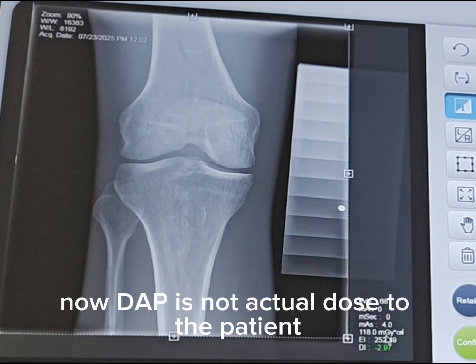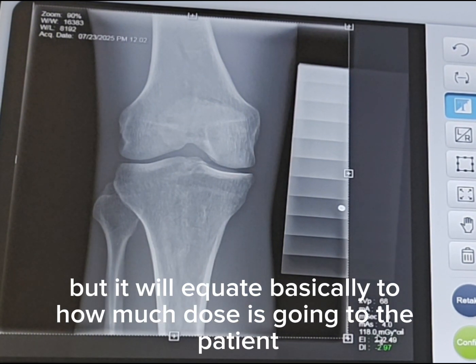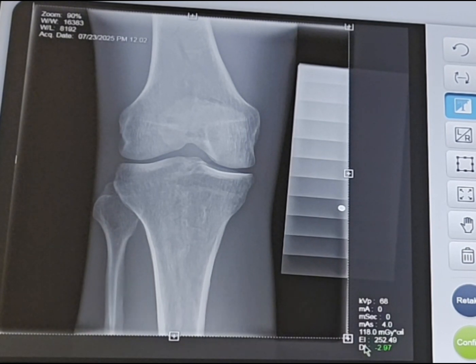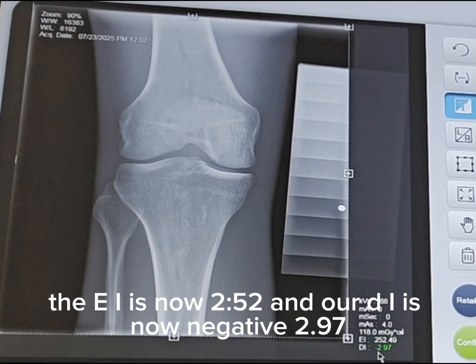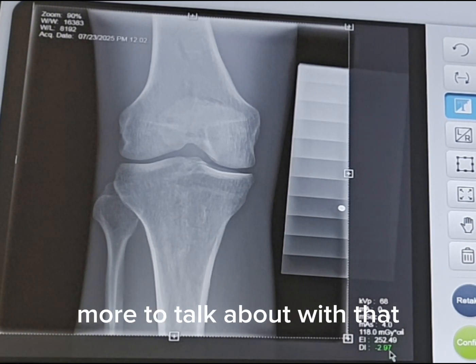Now, DAP is not actual dose to the patient. It's the dose area product. It's how much radiation is going to that area, but it will equate basically to how much dose is going to the patient. The EI is now 252 and our DI is now negative 2.97. Basically a negative 3. Ooh, more to talk about with that.